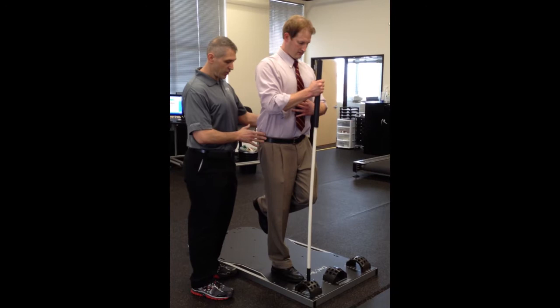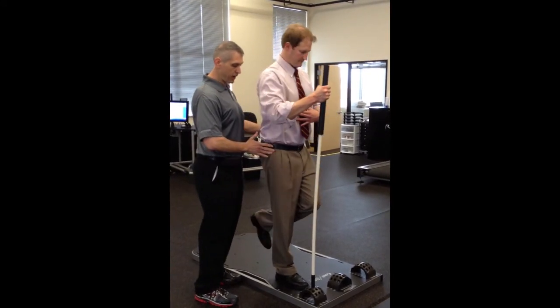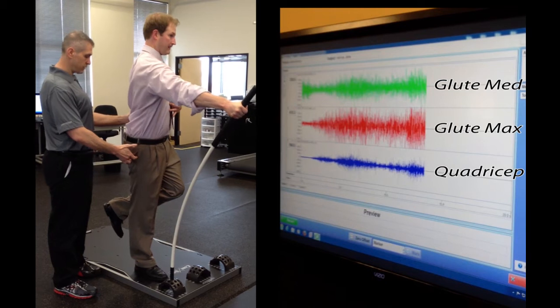Now I'm going to have you start internally rotated, starting there. You're going to externally rotate and press. Get taller, get taller, get taller — hold that. There it is, there it is. Look at that activation.